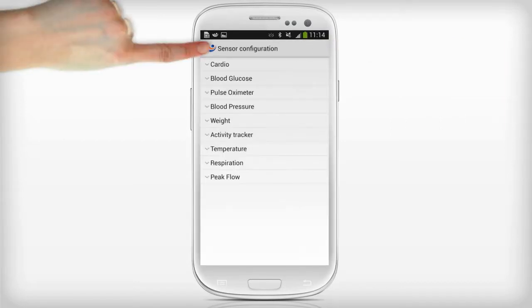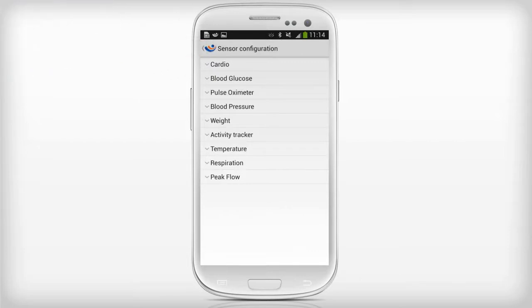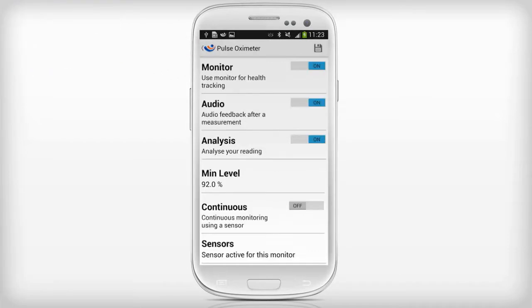Press return to go back to the monitor configuration screen. You can see that the sensor has been activated for this monitor.